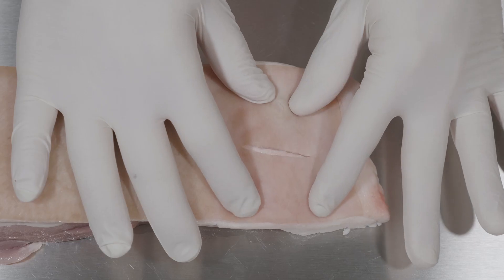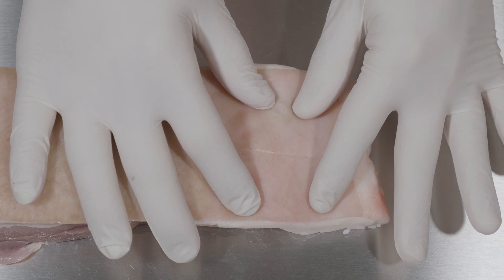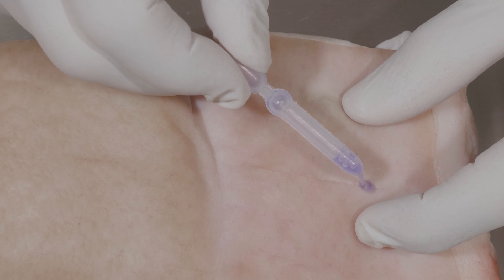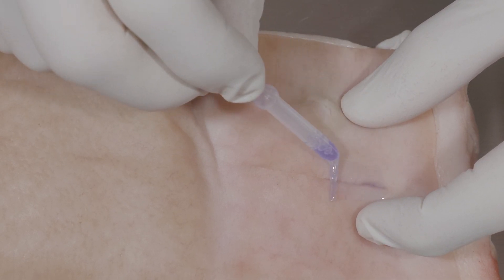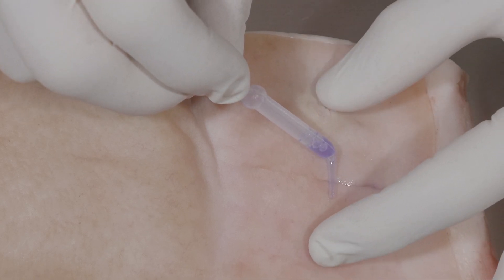Glue Stitch is useful in closing wounds in areas of low tension that can be approximated easily. Simply bring the wound edges together and apply Glue Stitch along the wound margin. Rotate the pipette and smooth Glue Stitch into a thin adhesive layer using the edge of the pipette.